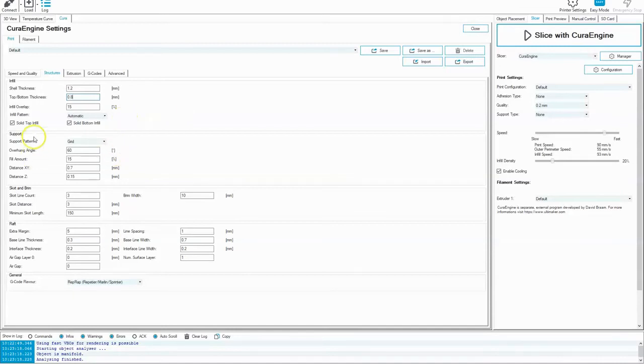As I keep coming down here, support, I usually haven't changed much as far as overhang angle, and it doesn't need any supporting. Skirt and line count here, definitely run 3. I would not go less than 3 because you want to have the filament coming out of that nozzle before it starts printing and make sure it's really up to temperature. So make sure that's all set. It does not need a raft, so we'll not even worry about that.